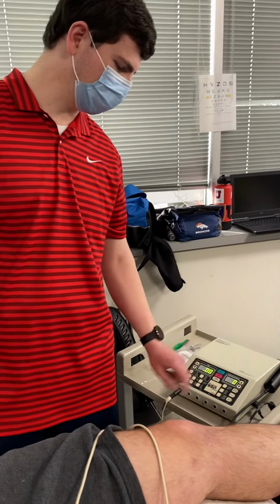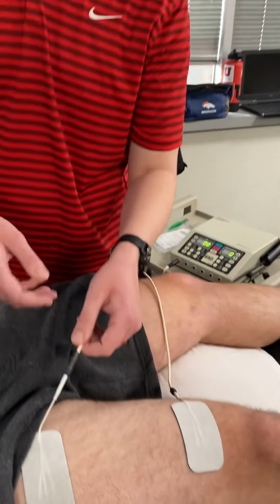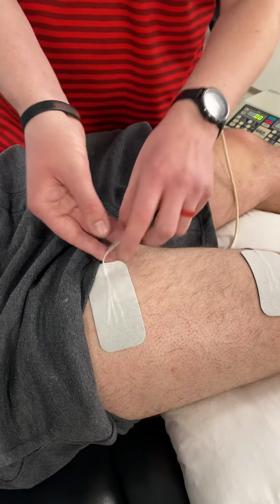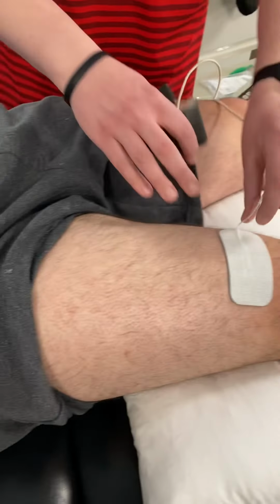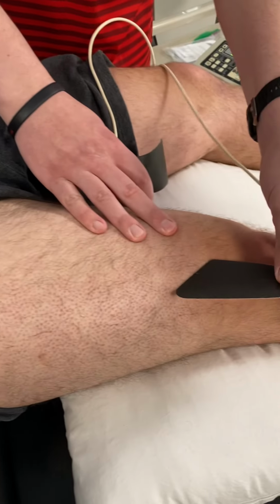And I'm going to stop that so that we've already done 20 contractions here with Stefan. I'm going to remove the pads and check underneath. He doesn't have any tissue damage there. He doesn't have any tissue damage here.